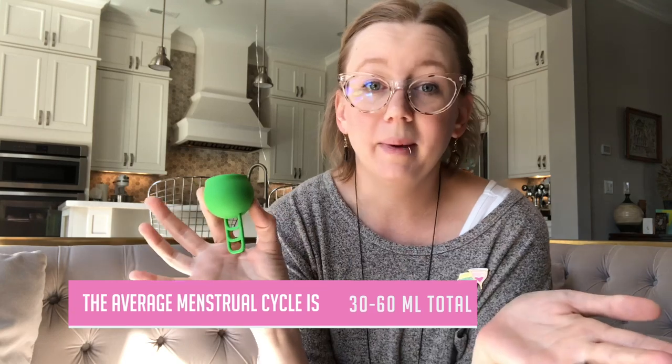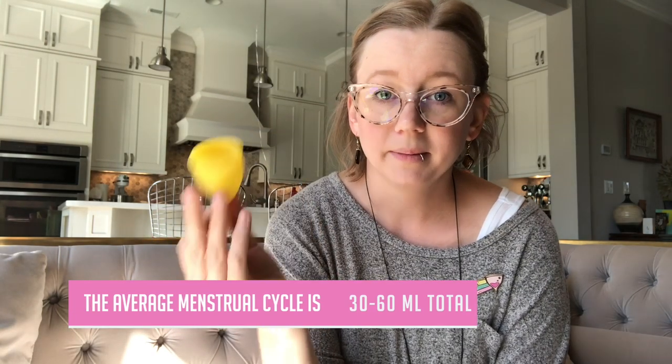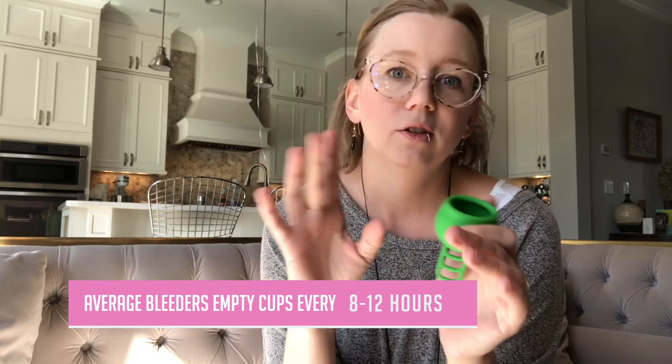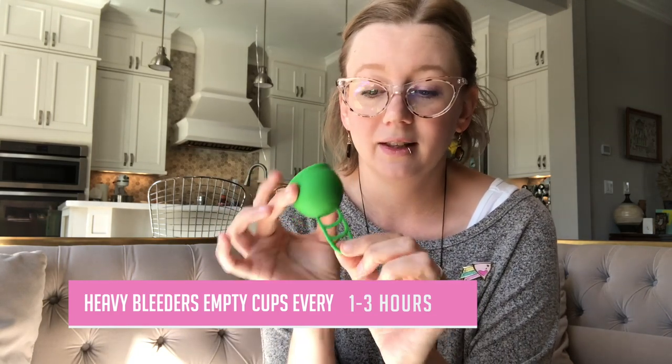The capacity is 38 milliliters, which is big by any cup standard. A lot of these bullet-shaped cups — Diva cups, Uni cups — their size 2, which are usually their longer cups, are about 30 milliliters. The highest capacity cups on the market tend to go to about 40 to 41 milliliters, so 38 is really good. If you have a low cervix, this could be a lifesaver for you.